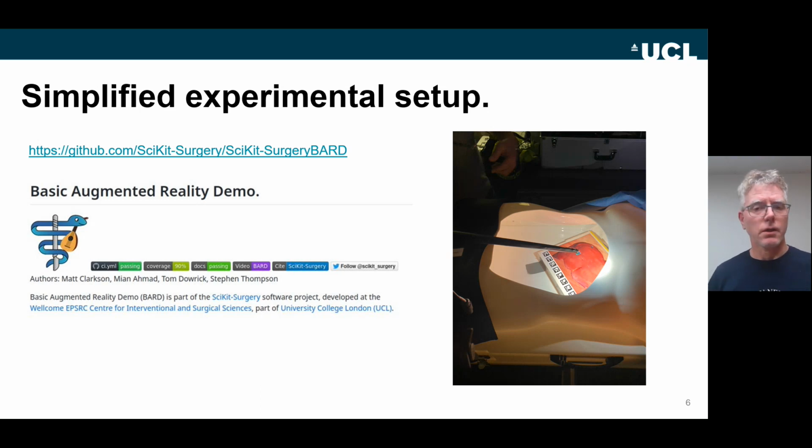It can use surgical tracking systems like electromagnetic tracking systems or optical infrared systems. Or in the example we used in our lab, we're just using Aruco tags, which you can just see in this image of our paper phantom inside our plastic torso phantom.